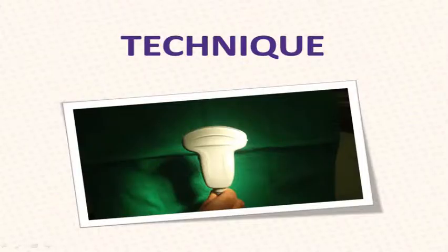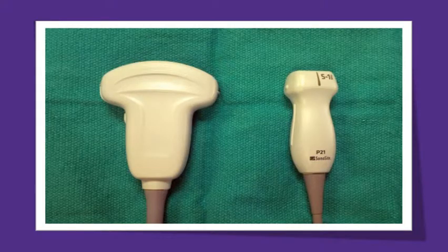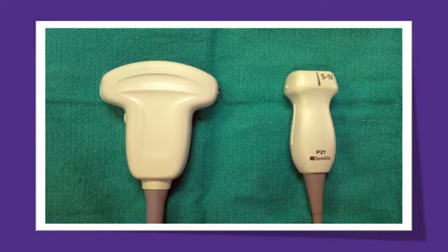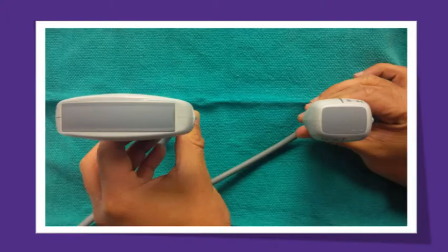Now let's move on to the actual hands-on technique in generating these images. As with all of our basic applications, this point-of-care aorta assessment can be done with either the curvilinear or the phased array probe. Either of these probes can be selected from the Triple Connect system on all of our Sonosite units. As you begin your training, you may find the curvilinear probe a bit easier to use. Many find the nature of this probe a bit easier to grasp probe technique, and the larger footprint of this probe may help in the assessment of the abdominal aorta by causing more displacement of bowel as you interrogate the abdomen. As you gain confidence, the phased array probe is equally suitable for this study, with only a few minor adjustments required to optimize scanning.